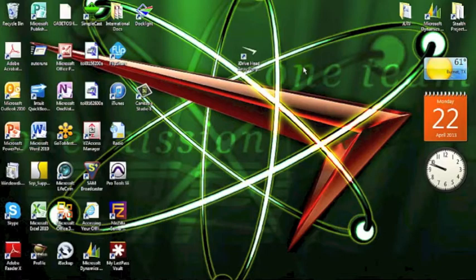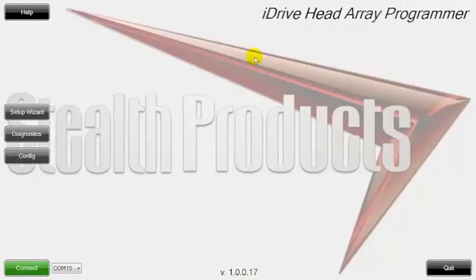The first thing we're going to do is click on the iDrive head array programmer icon, which is right here, with the Stealth boomerang logo. Now that you've clicked on that, we've actually opened up the programmer. A couple of things to mention quickly are the version of the software on the program, which you can always tell down here at the bottom — we're on version 1.0.0.17.